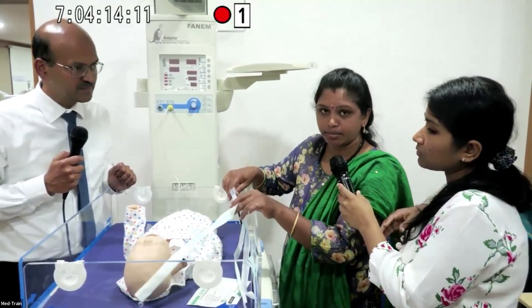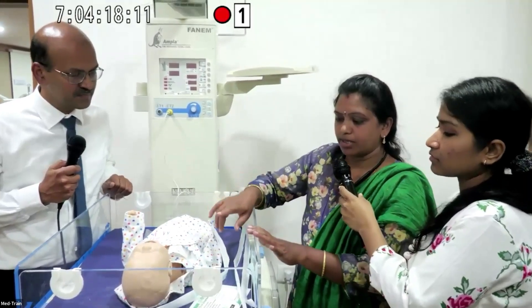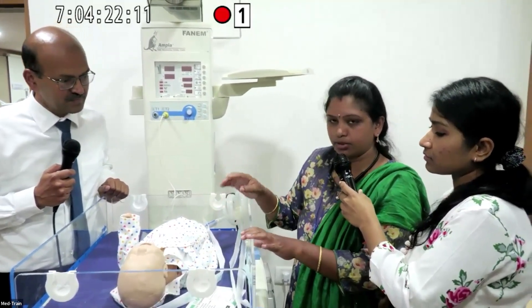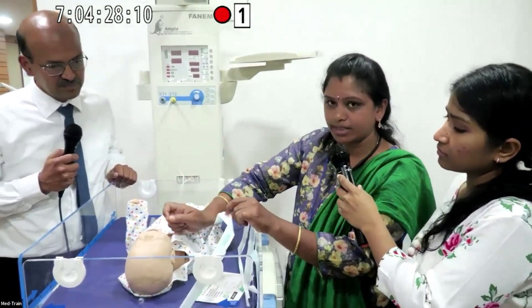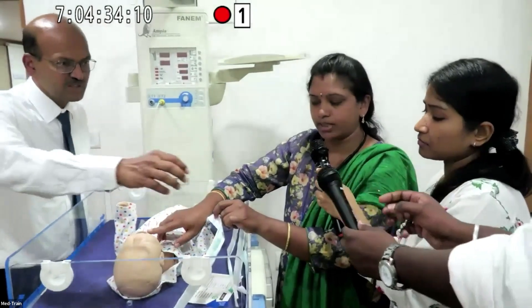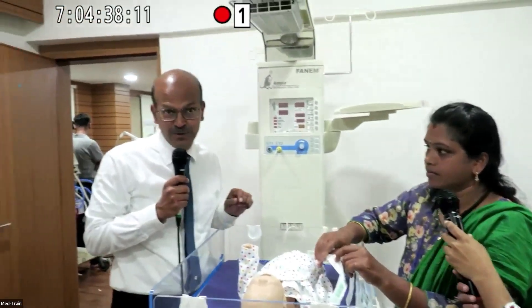If the baby is on CPAP, you can still perform suctioning — wear gloves first. You can suction orally up to five centimeters. In the labor room, the mouth is suctioned first, then the nose.